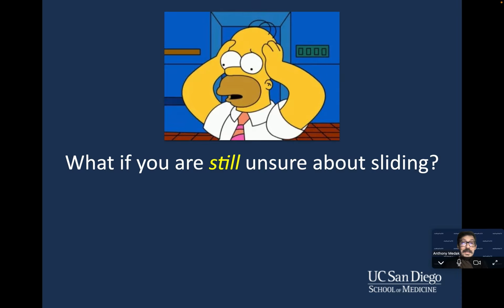Now, one last step to describe before we wrap up. And that is, what if all this talk of sliding doesn't make sense to you, or when you look at it, you don't really see it, you're kind of scratching your head.